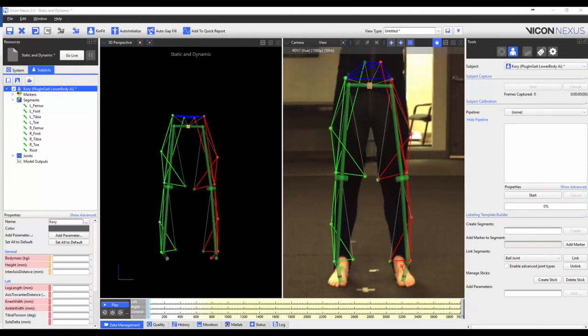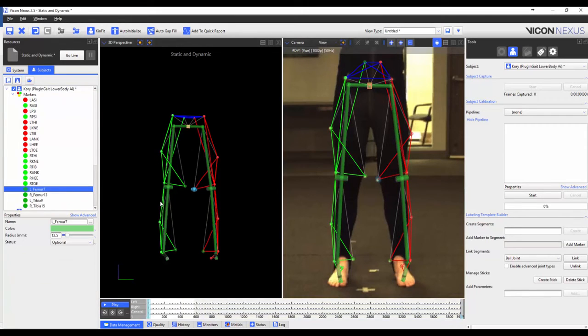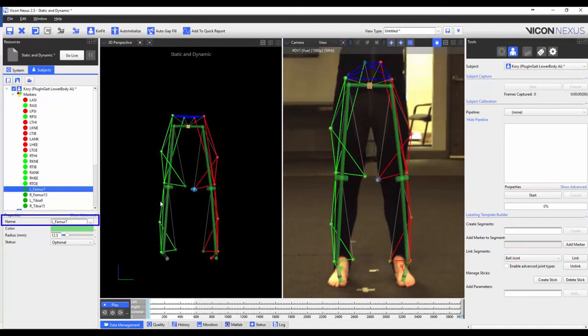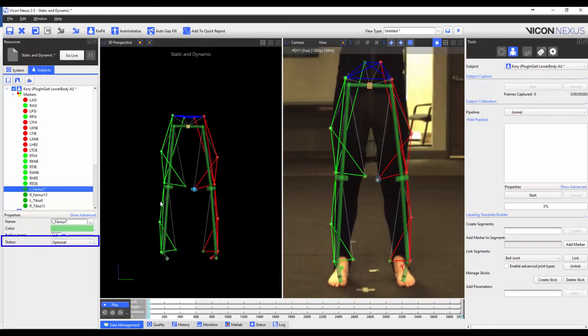Now that I've added the extra markers we can see them in the markers list. I could change the marker properties. This means that I could change the marker names, the color, the radius, or the status. And I could also reorder the marker list.